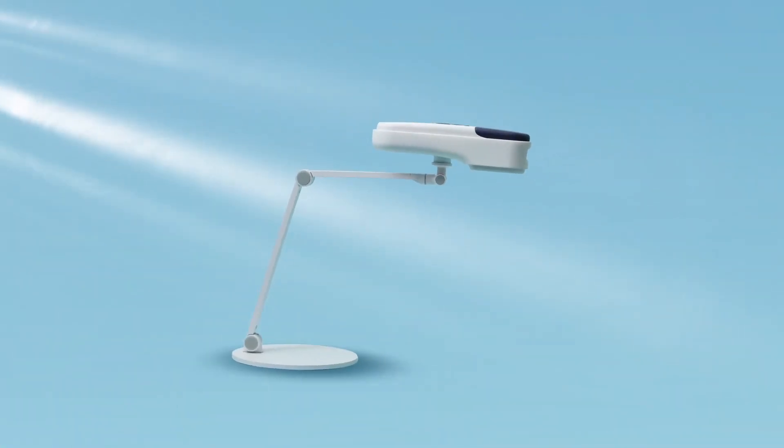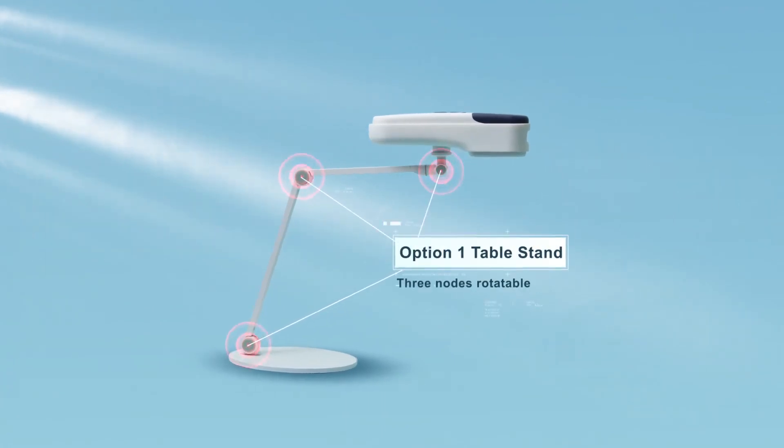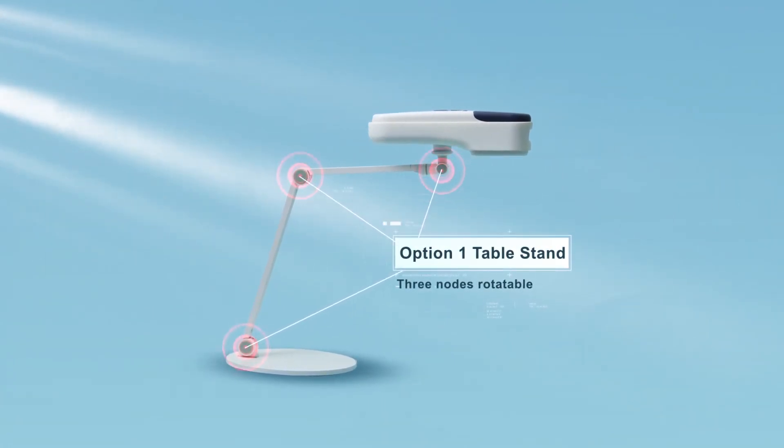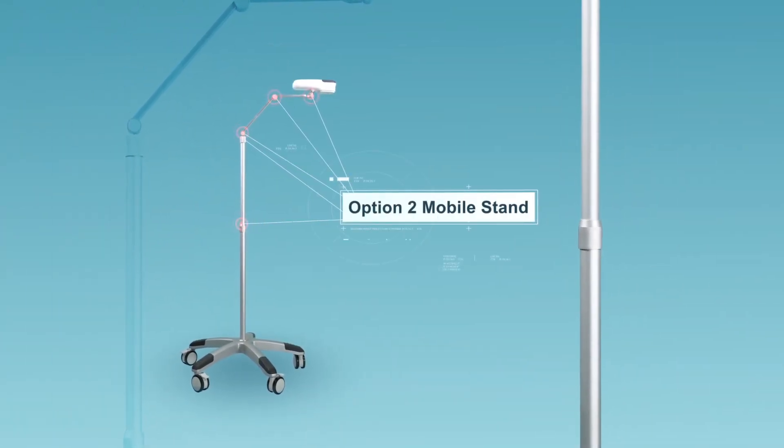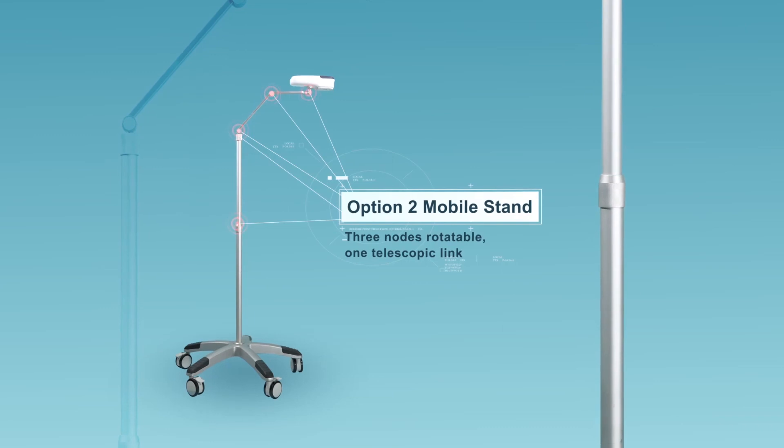Option 1 is the Stable Stand, which supports angle rotation and height adjustment. Option 2 is the Mobile Stand, which allows angle rotation and height adjustment by a wide margin.